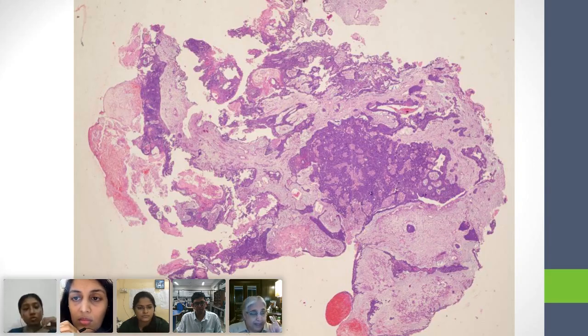So now you've got basaloid cells, and the stroma, which is very loose and looks grayish blue, and you have these epithelial cells. But you notice clearly here, as Kshitija mentioned when she first described it, that amidst all of this there is one large area that looks more blue and more solid. So we have areas that are less solid and areas that are more solid, which have this basaloid character. All right, now let's go to the next thing.